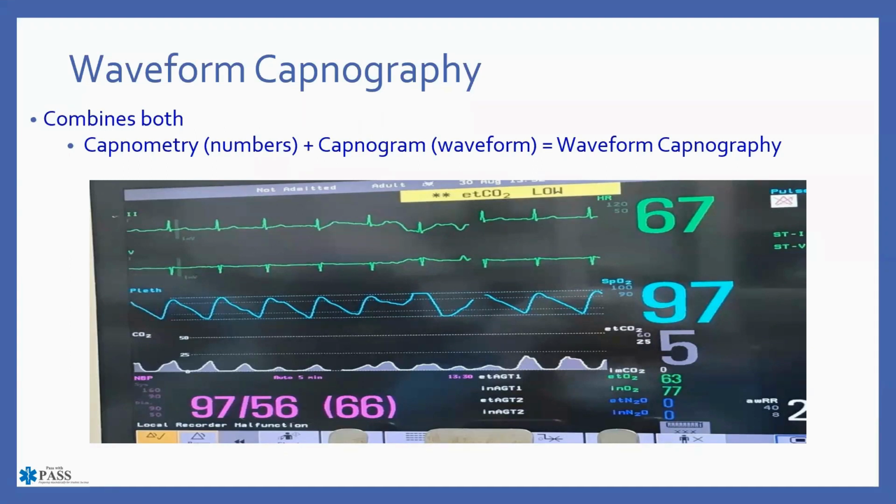But quite simply, the registered nurses or ER nurses in a lot of these situations are just not educated on it, to be totally honest with you. And it's not that they don't have the ability, it's just they have not had the opportunity to have the education in one of their breakout sessions or whatever. So they're not real familiar with the capnography, but I do think that it is getting better.